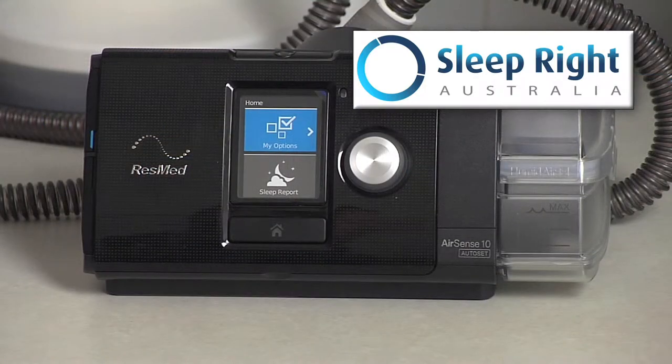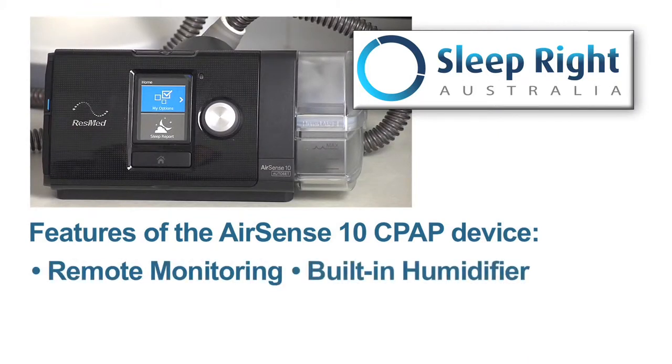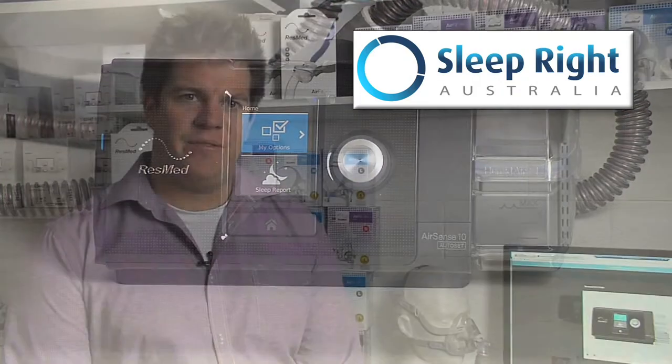My three favourite features of the ResMed AirSense 10 devices are the remote monitoring, which we've discussed in a different video, the built-in humidification which is really easy to clean and has several different settings we can apply within it. The machines are also a lot quieter than previous models of CPAP device. With its ease of use, compact design and remote monitoring, the ResMed AirSense device has become a very popular machine among CPAP users.